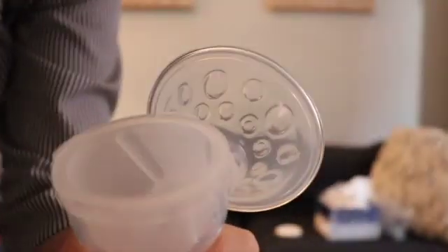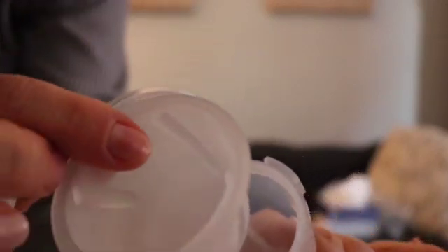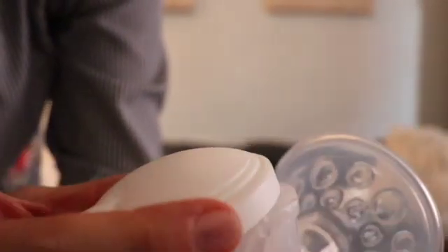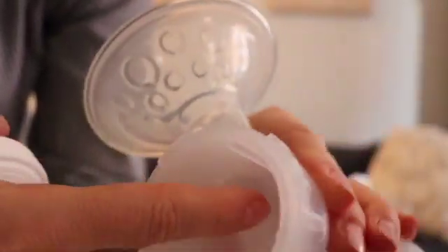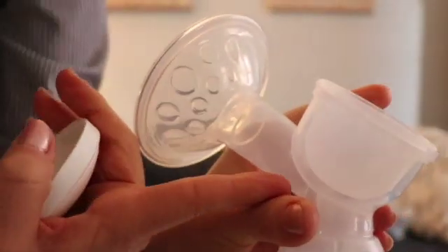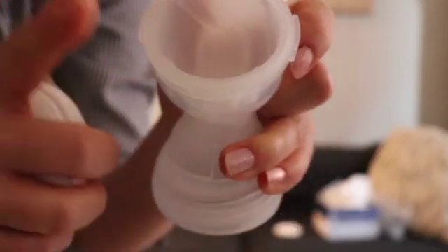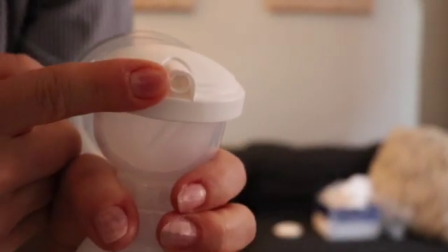On the back of the flange, you're going to see where the tubing is going to connect, and this cap comes off, and there is a soft squishy diaphragm in here, which I'm sure is involved in the suction of the pump itself. Looking at this setup, because this is a cup that goes inside and it's totally closed, there's absolutely no way that milk could backflow from the flange up into the tubing. Just looking at this, I know that this is a closed system, which is amazing. You're gonna put this back on, it kind of screws into place, and you'll connect your tubing back here.